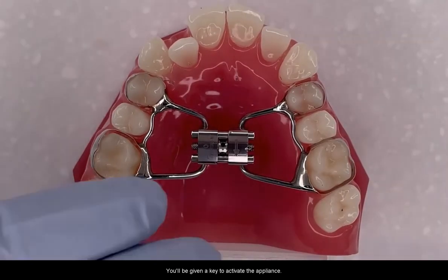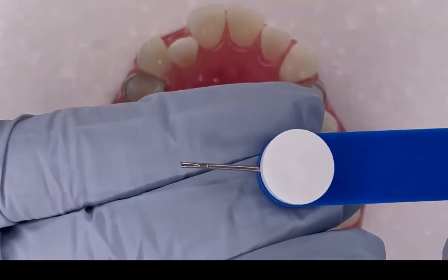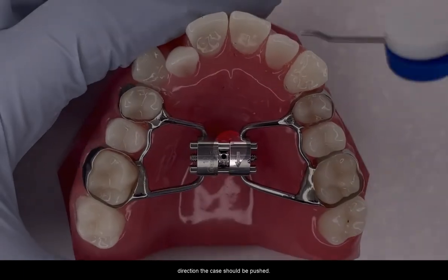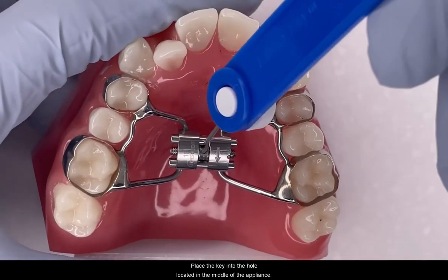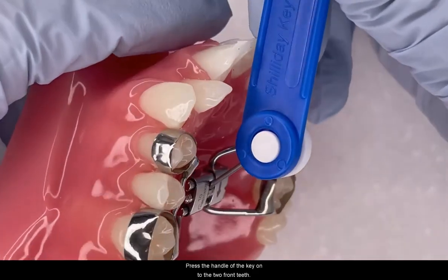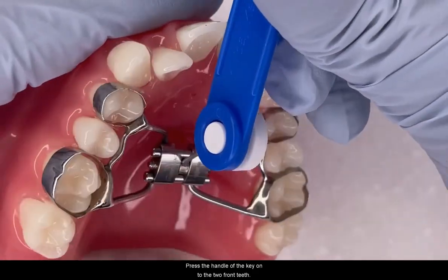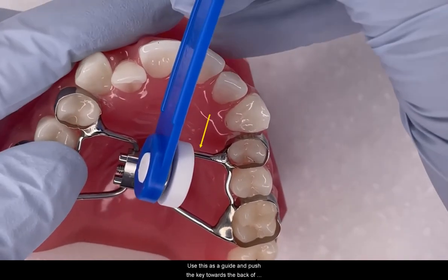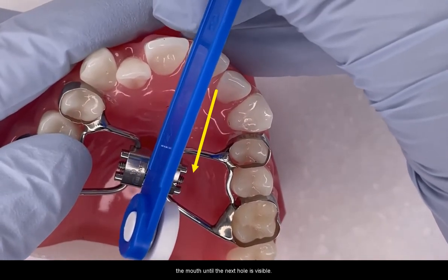You will be given a key to activate the appliance. There are arrows on the appliance pointing in the direction the key should be pushed. Place the key into the hole located in the middle of the appliance. Rest the handle of the key onto the two front teeth, and use this as a guide to push the key towards the back of the mouth until the next hole is visible.